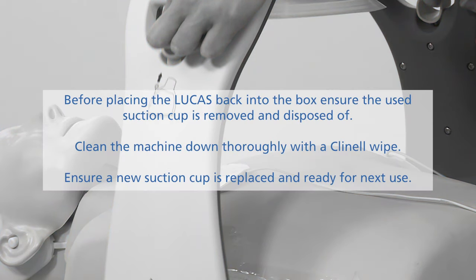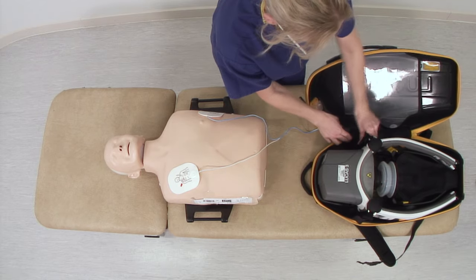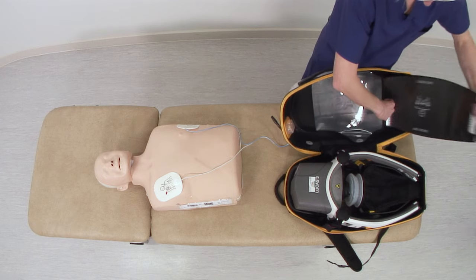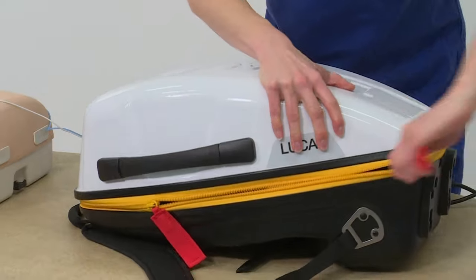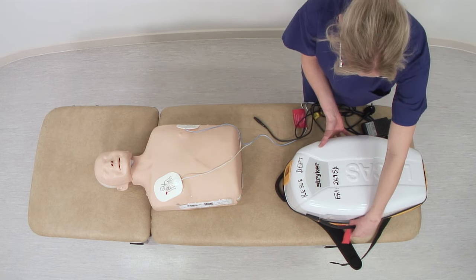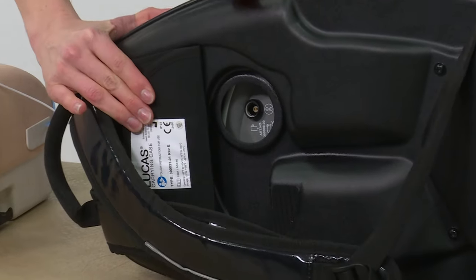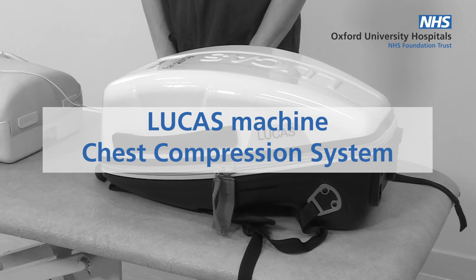Before placing the Lucas Machine back into the box, ensure the suction cup has been removed and disposed of. Clean the machine down with Clinell wipes. Ensure a new suction cup has been replaced and it is ready for next use. The backboard slides into the lid. Ensure the device is placed back on charge — the charging cable socket is on the back of the box. We hope you found this video useful. Please contact your site resource practitioners for more support if required.